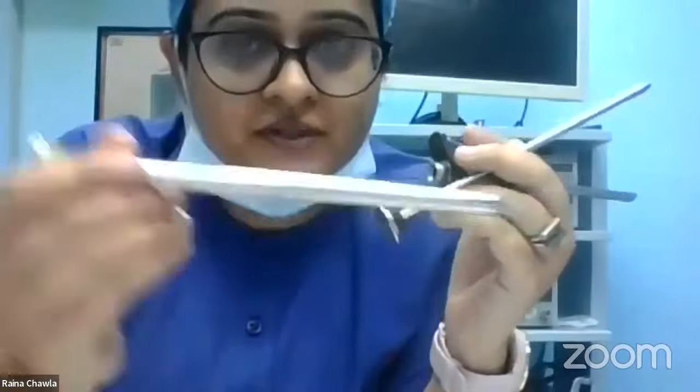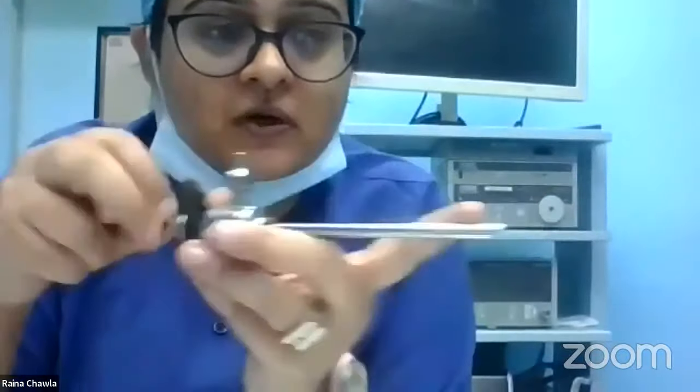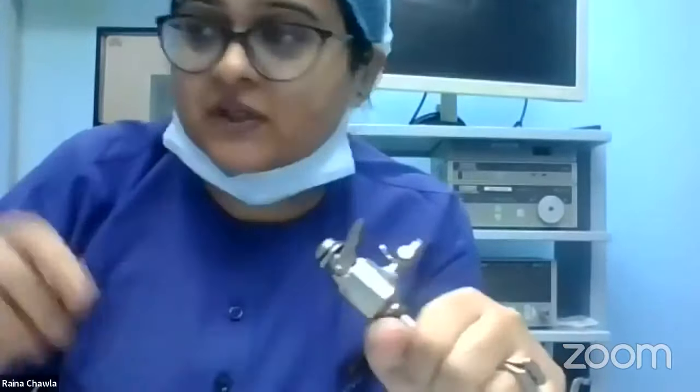Okay, so this is a secondary port. So I said we can either use a primary port. Okay, this is the trocar to create the primary port. You can see it's a 10 millimeter port through which we introduce the laparoscope. For the secondary ports, we use 5 millimeter ports. So this is a trocar, and this is the sheath I was talking to you about. This is a cannula. So we introduce this, okay, and then we remove the trocar, okay, and through this we introduce our different laparoscopic instruments. Okay, so these are our secondary ports.